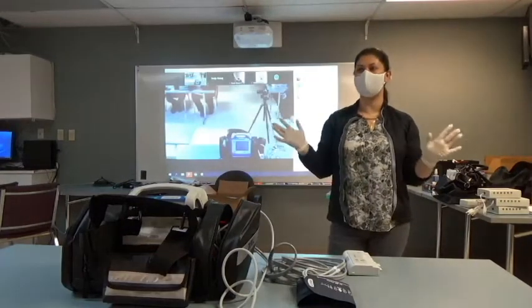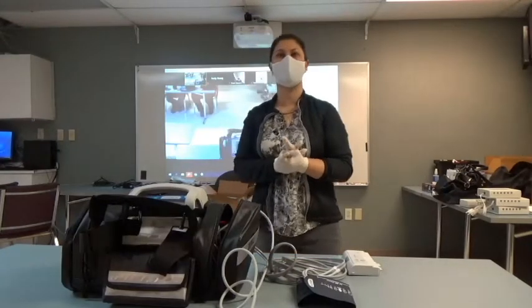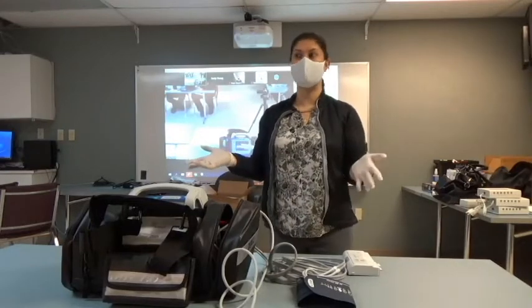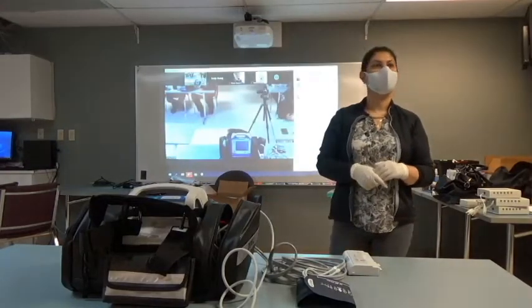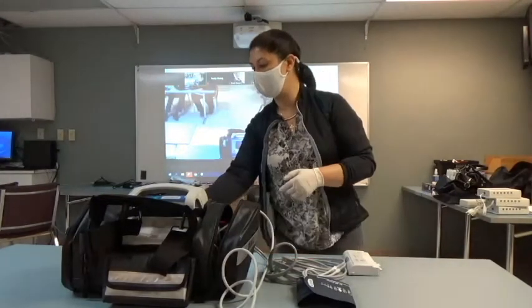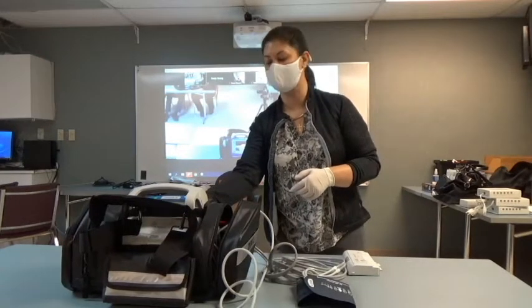So help me out. Today's my first day at Zoll. I see a picture that has a bell on it. What does that do? Alarms. Alarms, it's an important button because it makes things quiet. What about the house? Yep, takes you home. You have navigation keys that go clockwise, counterclockwise. The circle is going to be your enter or select key.